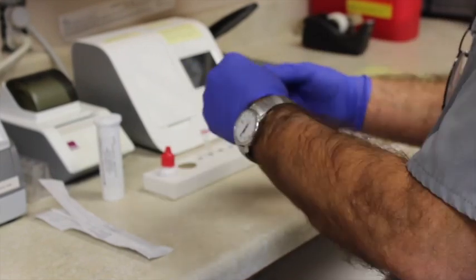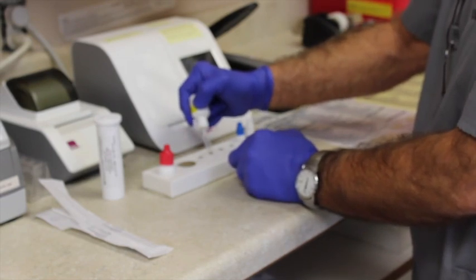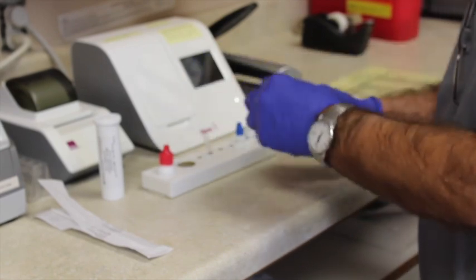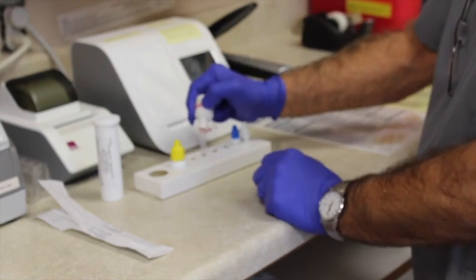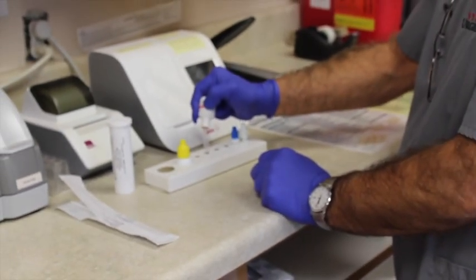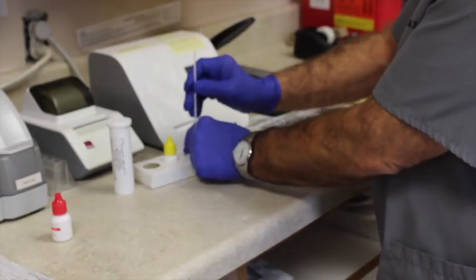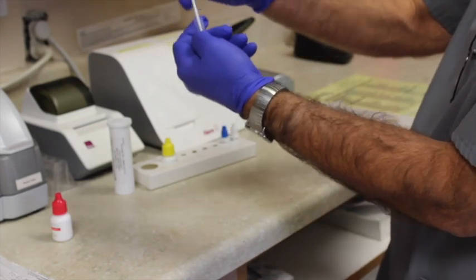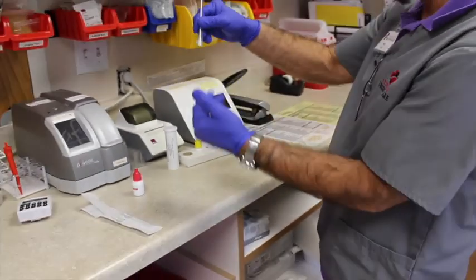You want to put in four drops of each buffer and the reagent into the tube. Then you've got your swab with the specimen, and you swirl it in the tube ten times, and kind of smoosh it around a bit so it's really exposed.